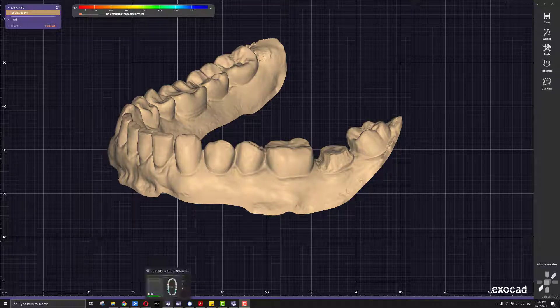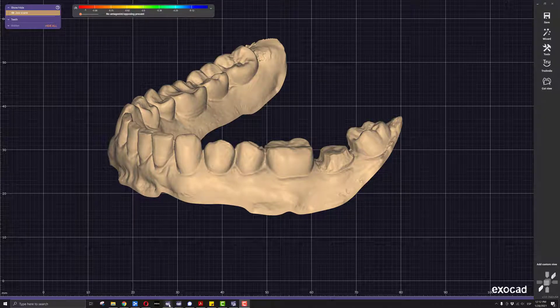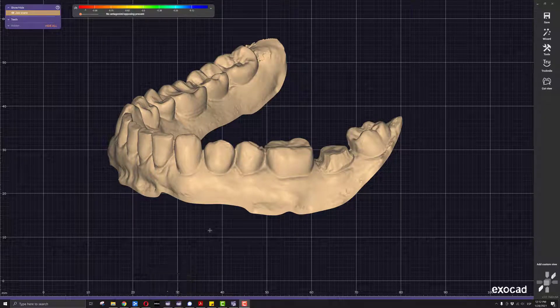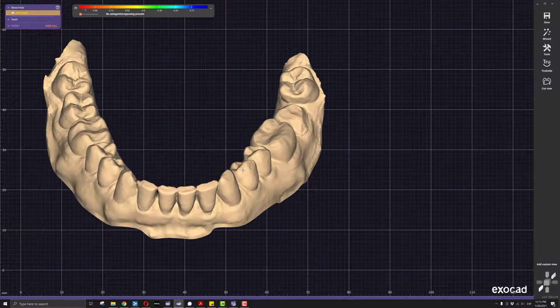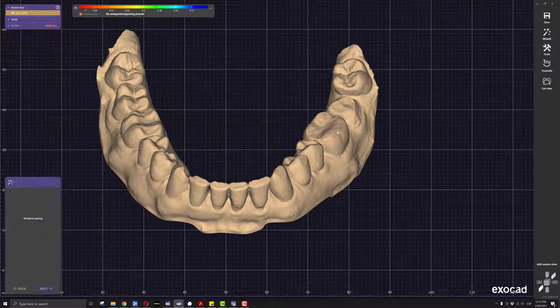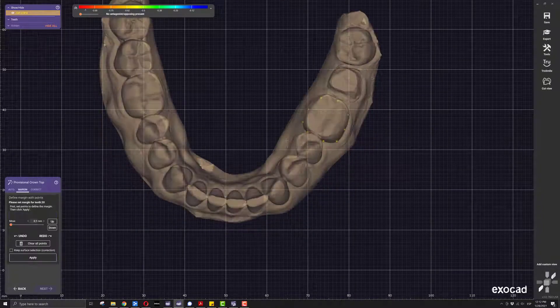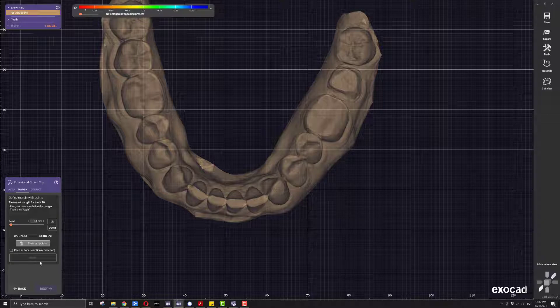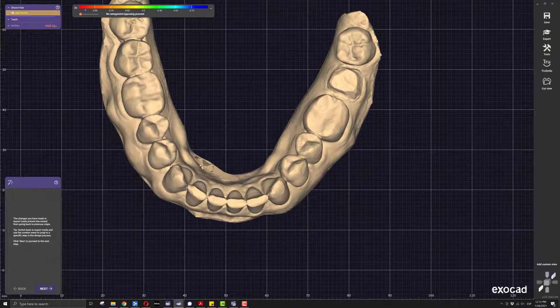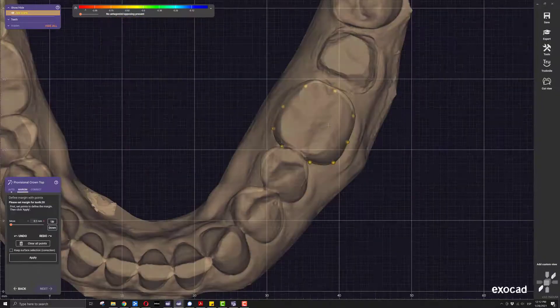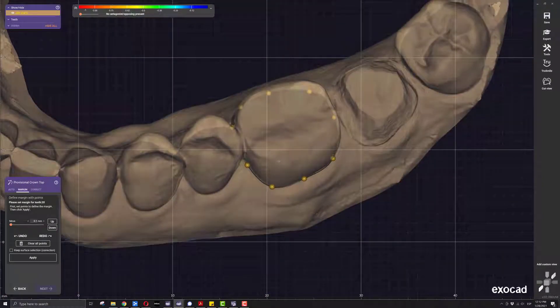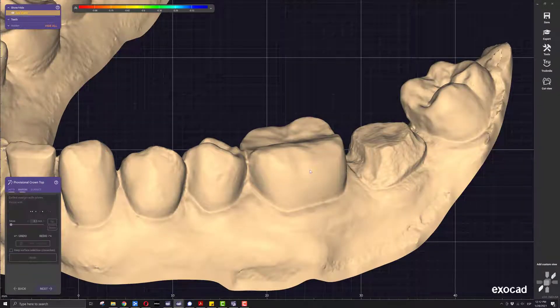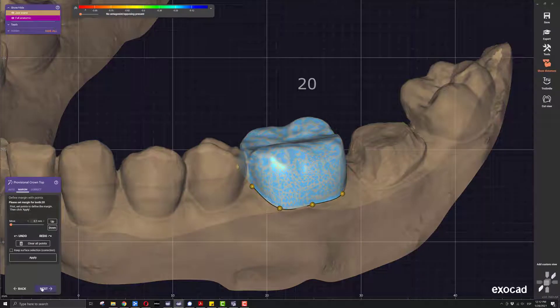First, order form creation. We are going to be selecting our order form as a provisional or eggshell crown — that's all we need to select. Then we go here into the wizard. The software is going to ask us to click on the tool that we want the software to create a provisional on, so we will go ahead and click on the molar. Everything is selected, and then we move forward.